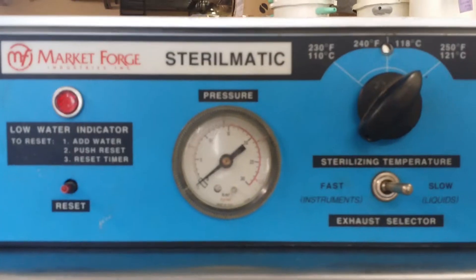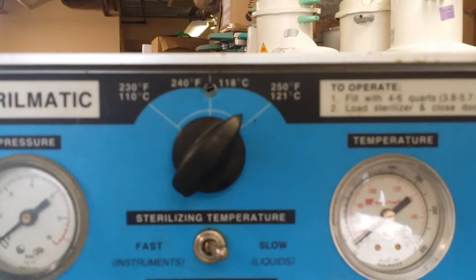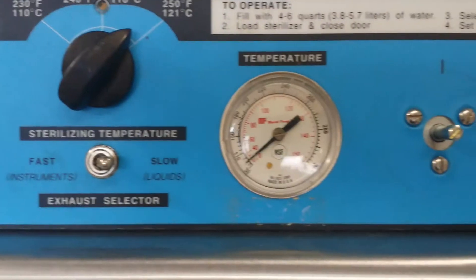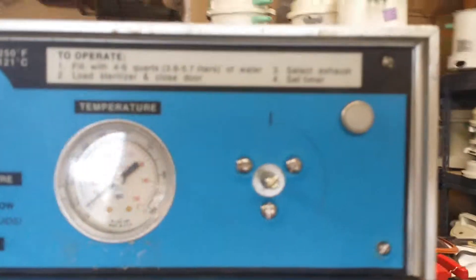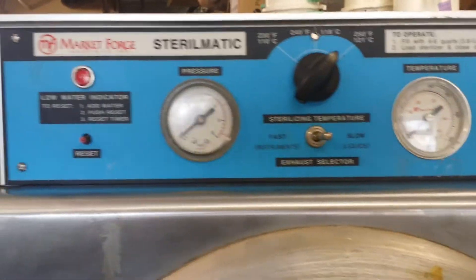From the top, here is the pressure gauge. The temperature is adjustable from 230 to 250 Fahrenheit. Here is the temperature gauge, and here is the timer — we didn't put it back yet.